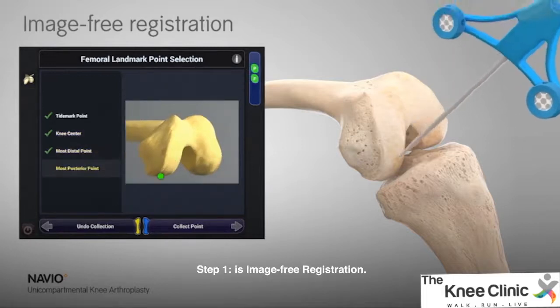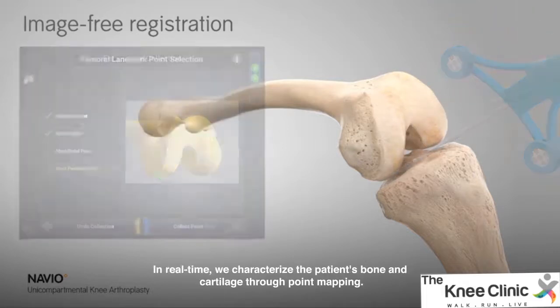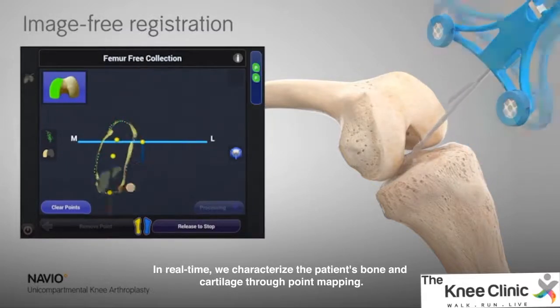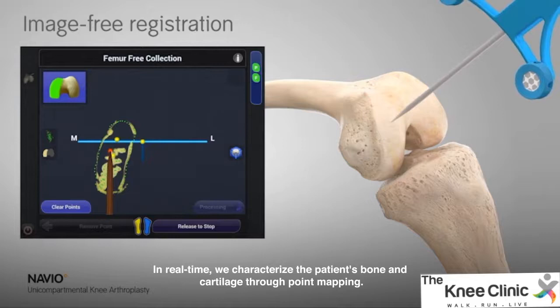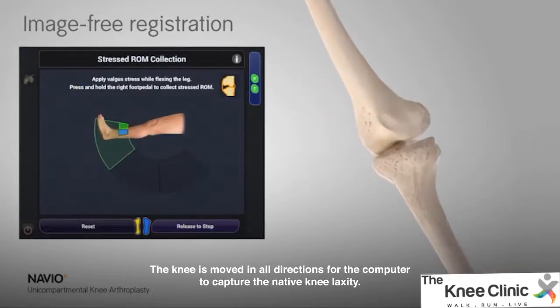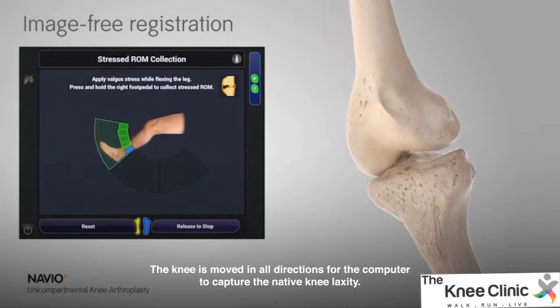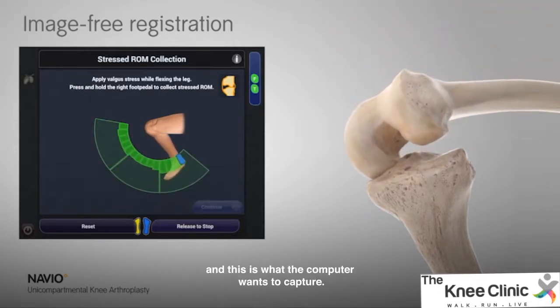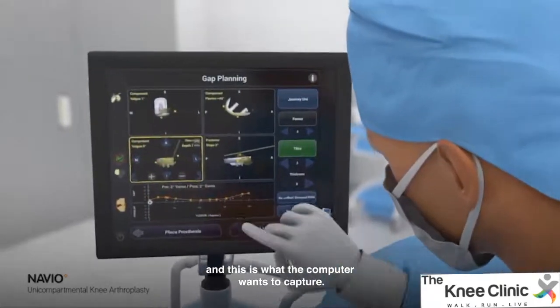Step 1 is image-free registration. In real time, we characterize the patient's bone and cartilage through point mapping. The knee is moved in all directions for the computer to capture the native knee laxity. Every patient is different and every patient's knee is different, and this is what the computer wants to capture.